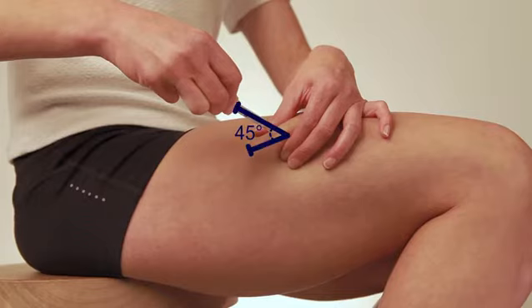Inject your medicine in a slightly different place each time. If you want, you can inject in your abdomen instead of in your thigh.